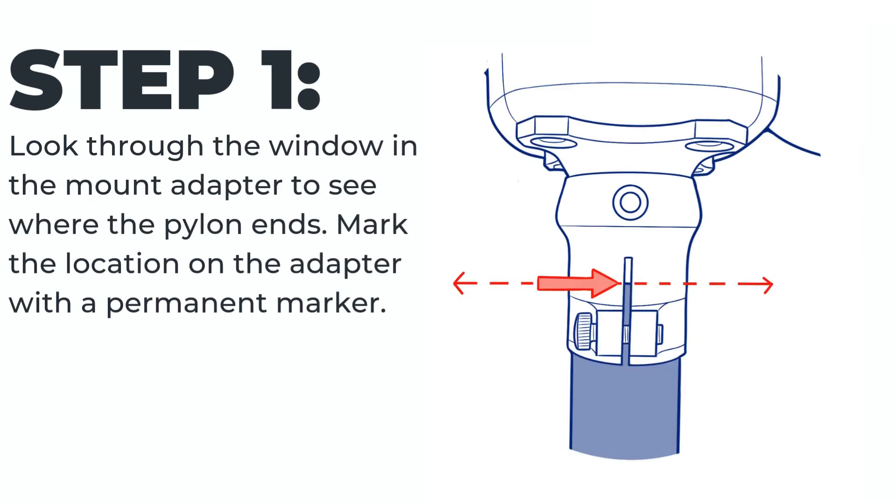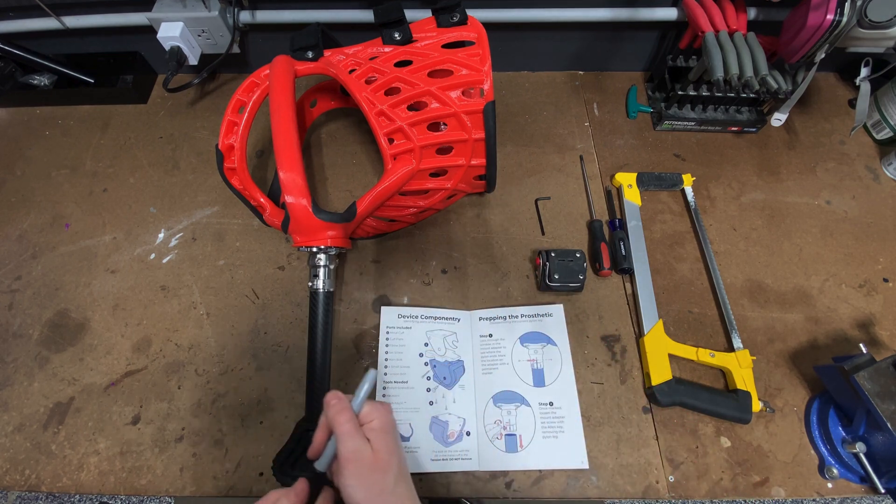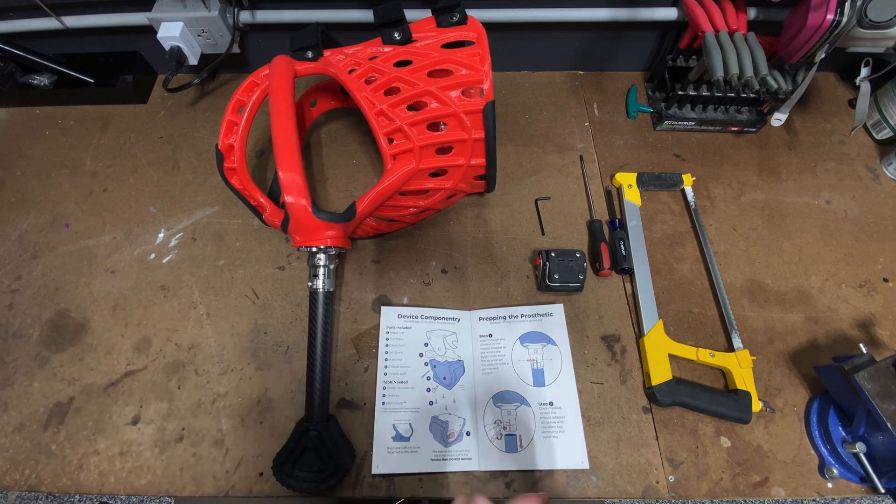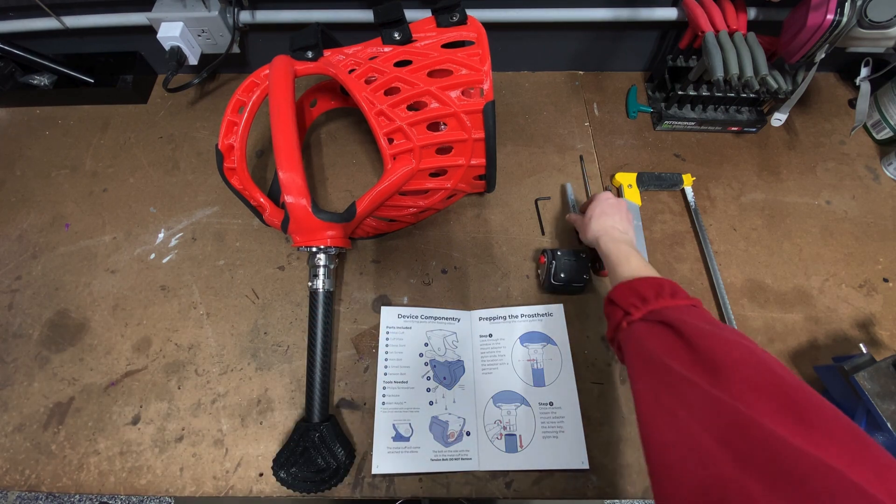Step one: look through the window in the mount adapter to see where the pylon ends. Mark the location on the adapter with a permanent marker. This height will be different for everyone. If you already have a mark on your adapter from when you got your device but have since changed the height of the leg, you can easily remove the old mark with alcohol before making a new one.